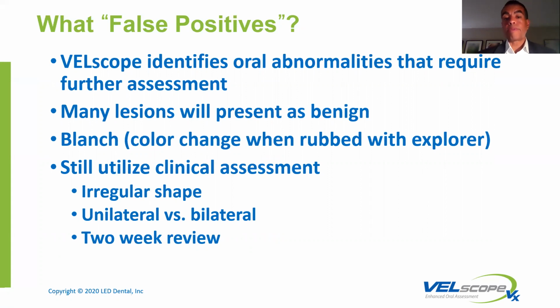The great thing is we can take a picture and send that for some guidance before you even refer out. But at the end of the day, what we do know is if you follow these protocols, there's something that warrants a referral. There's something that warrants a diagnosis. And God willing, hopefully it's not cancer, but it's really important. There's this perception that if it's not cancer, it's a false positive. That's absolutely false. A true false positive is normal, healthy tissue that appears abnormal. Again, normal, healthy tissue that appears abnormal.